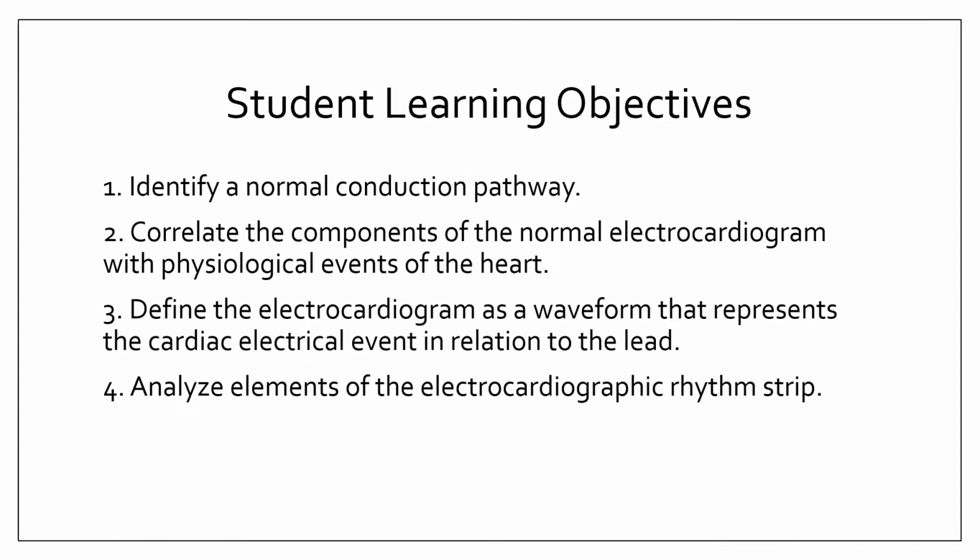So we have our student learning objectives today, and I know that you've already kind of dipped some toes into this last semester in Adult Health 1, where you learned some cardiac concepts, as well as some basic ECG rhythms. And today we're going to go over some more basic ECG rhythms and kind of add to your repertoire of interpretation, if you will. So let's do it together.